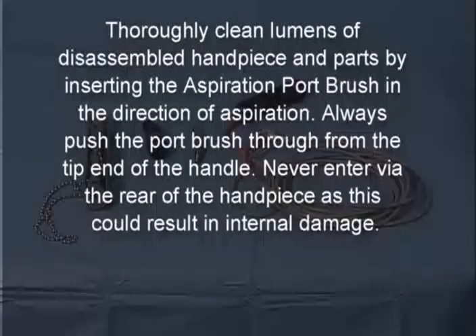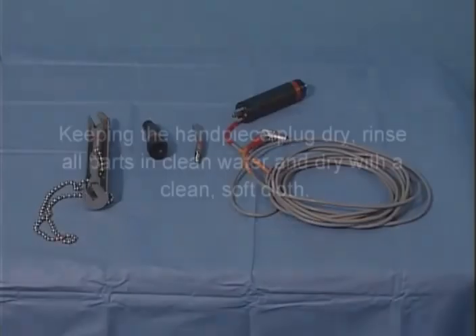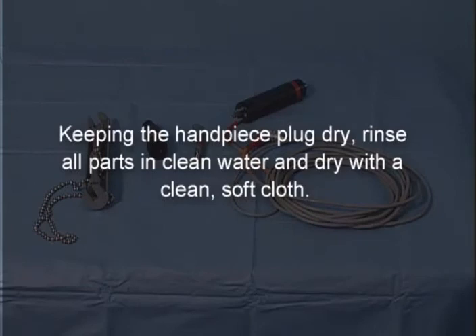Thoroughly clean lumens of the disassembled handpiece and parts by inserting the aspiration port brush in the direction of aspiration. Always push the port brush through from the tip end of the handle. Never enter via the rear of the handpiece, as this could result in internal damage. Keeping the handpiece plug dry, rinse all parts in clean water and dry with a clean, soft cloth.